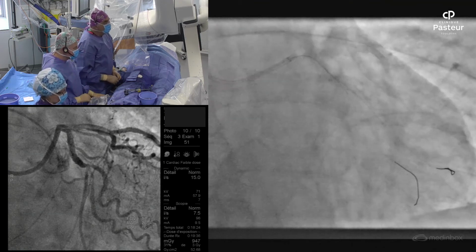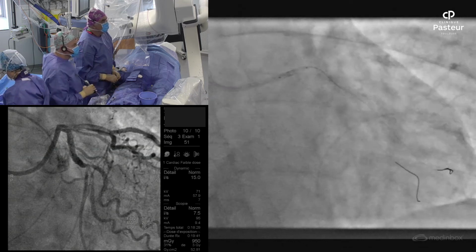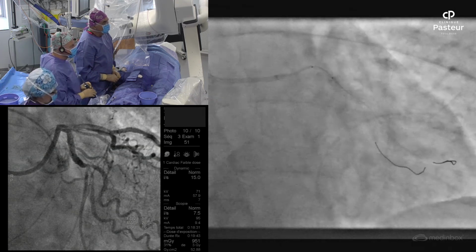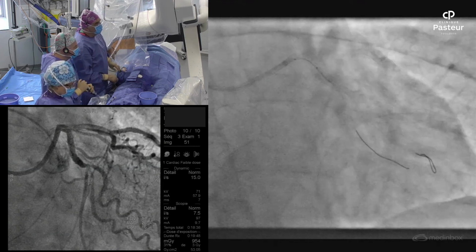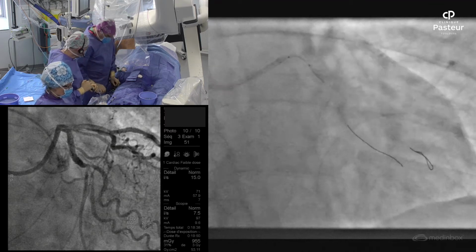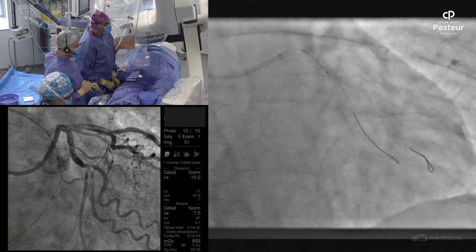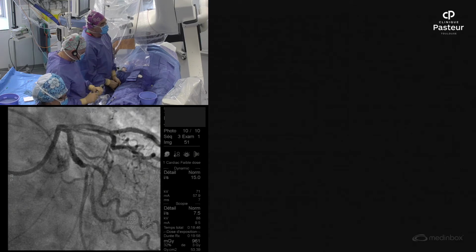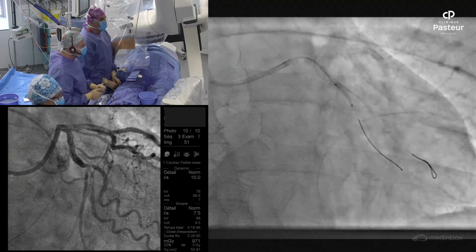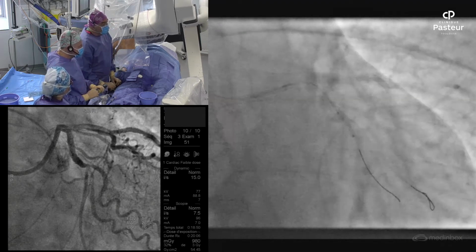But a hydrophilic wire is really interesting because it reduces the resistance, the friction, when you advance. So here maybe we have the wire twisted, and that's the reason why we have a problem. It's okay here. And you advance. Okay, now we can open the struts. Again, it's a 2.0 balloon. You see, 2.0 is enough. Maybe the 2.25, if we need a stent, will be enough.